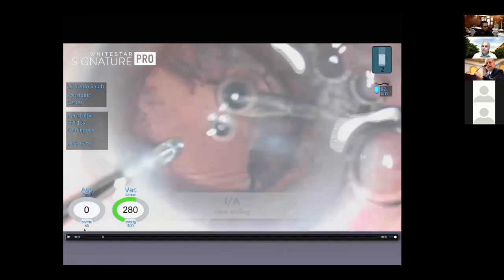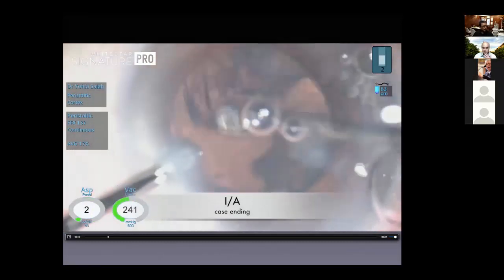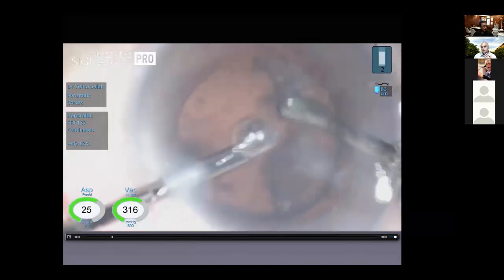Then you have a plan for how to manage. Always, if the posterior capsule is open, ask yourself the question: is there vitreous loss or no vitreous loss? Each one you will manage in a different direction. So the question has to be answered very quickly. So here, irrigation aspiration, look, everything looks fine.